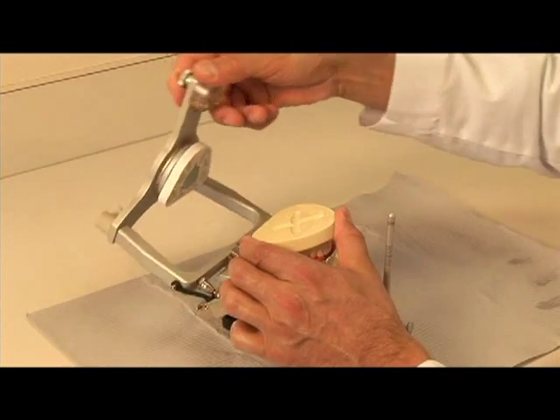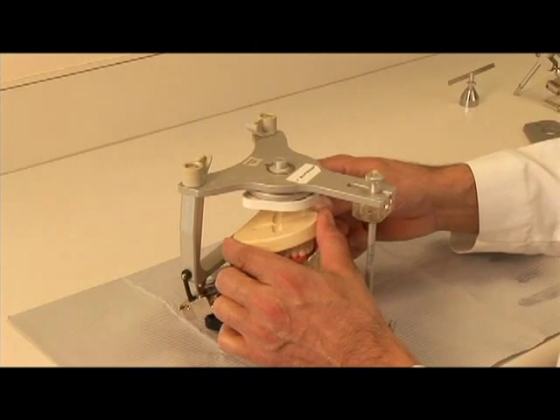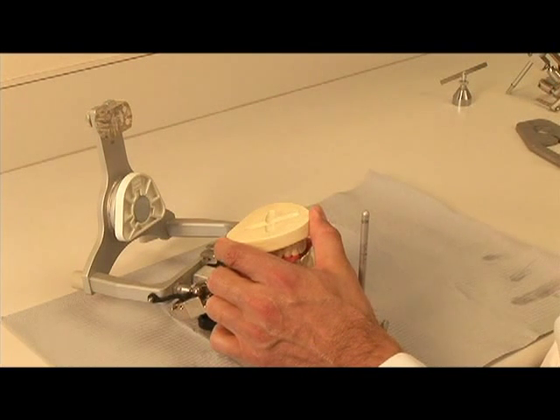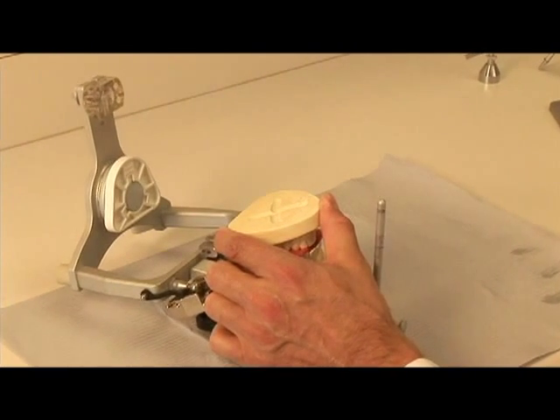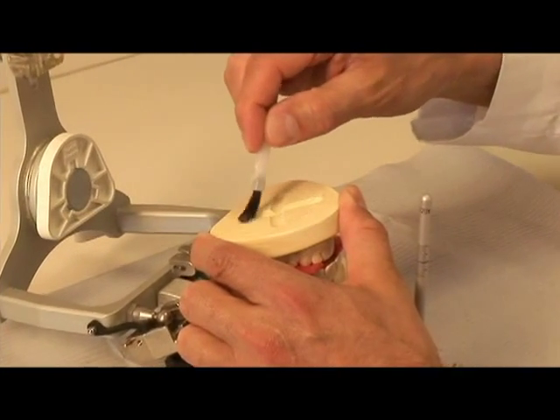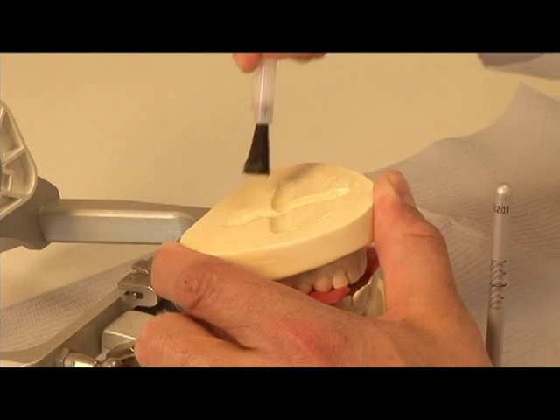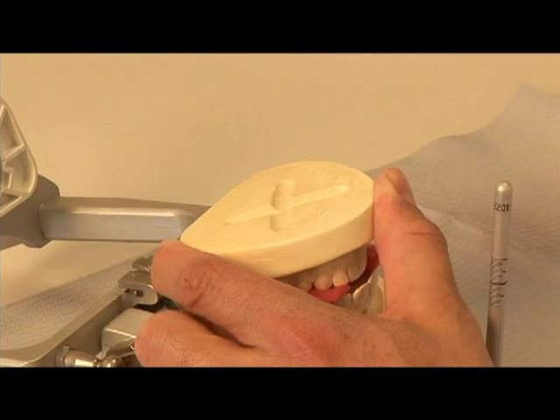Check to make sure you have enough clearance between the base of the mandibular cast and the lower mounting surface of the articulator. If necessary, remove enough of the base of the mandibular cast to have room for the mounting stone. It is recommended that you place a gypsum separating medium on the base of the cast, usually in the indexed area. This will facilitate the easy separation of the cast if needed. As demonstrated here, we're using Vaseline as our separating medium.